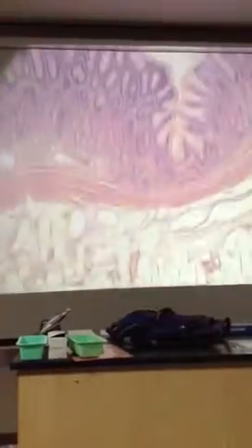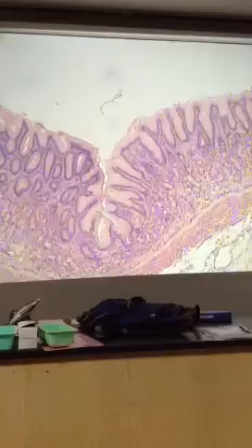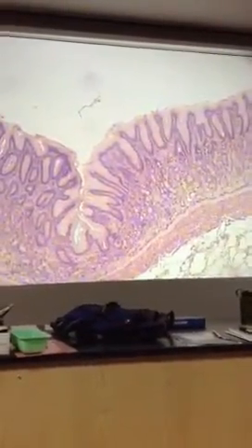Okay, I don't emphasize this slide too much. The mucosa layer is pretty good. The other ones are a little bit hard to see, they're not super well defined. So I'm not going to go any more into detail on that one. Are there any questions on that one?